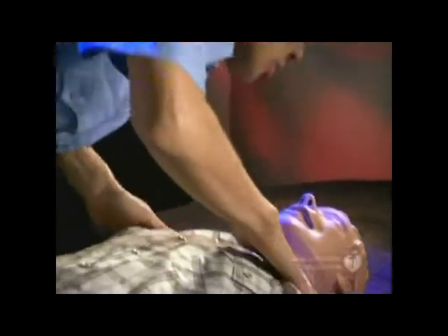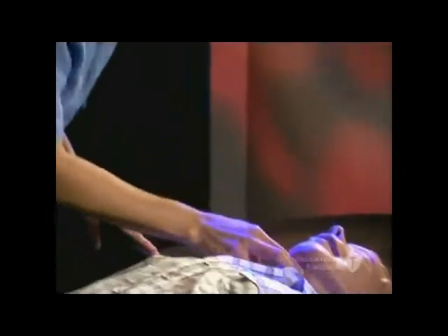Hey, are you okay? Sir, can you hear me? You activate the emergency response system and get an AED. Then check the victim's pulse.